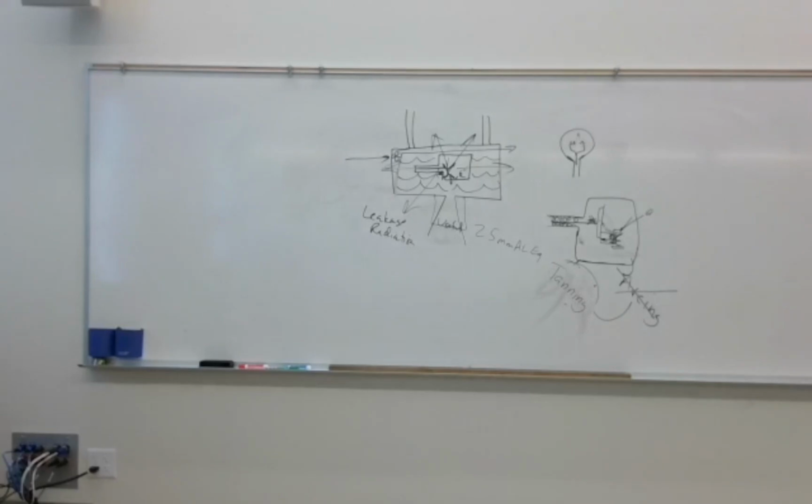So then it goes on to say this phenomenon is called the space charge effect. Space charge effect means that you've got as much mA going through that filament as you can possibly put onto the filament. So how can you get some of those off of the filament then?